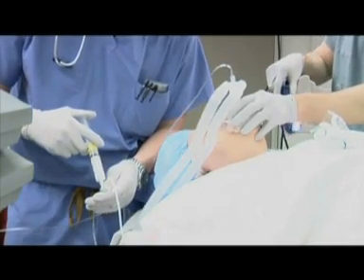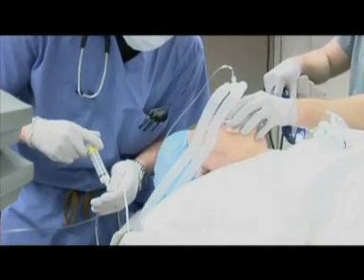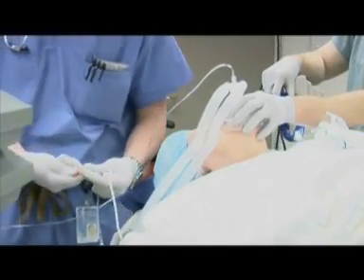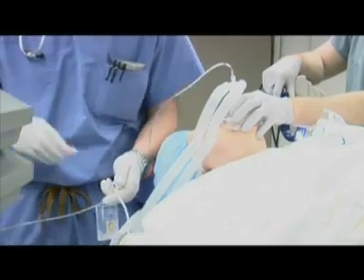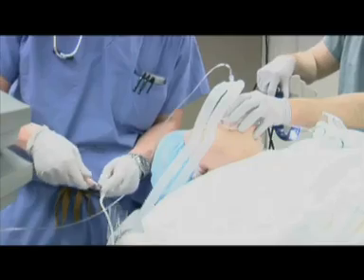For comparison, a Mallampati Class III patient is induced and intubated utilizing the Glidescope videolaryngoscope. Pre-induction sequencing with application of monitors, pharmacological agents, and verification of ventilation is similar.